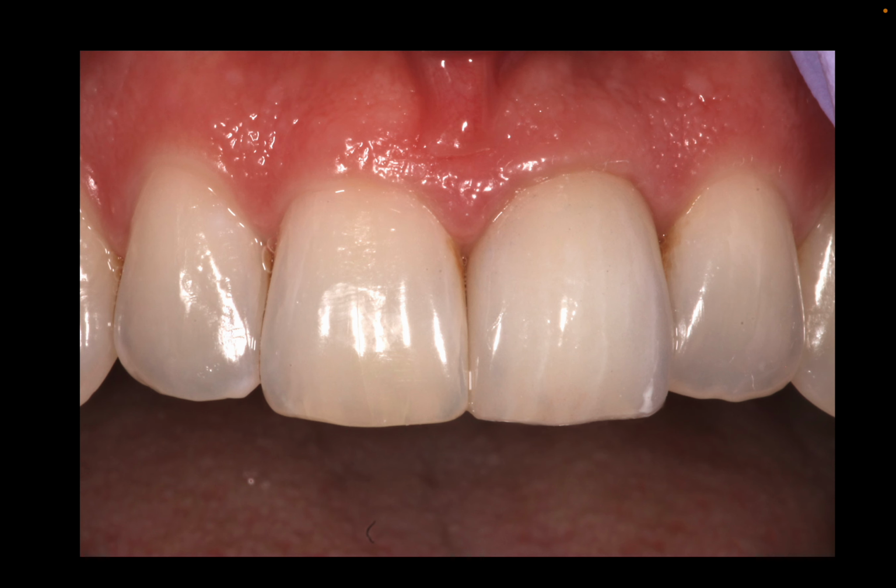The tissue will balance out and smooth out a little bit more over time, but I think this is really nice pink aesthetics. You'd be hard-pressed to tell that that's an implant restoration. The white aesthetics is pretty good. Value's just a little off, but overall I'd give this a solid 9 as an endpoint result. It's pretty believable from conversation distance. Another little trick, and it's a bit of a tangent, but look how nice the distal papilla looks.